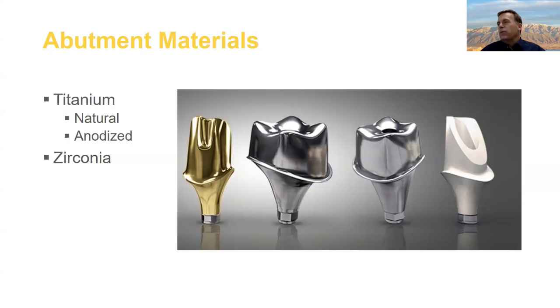But let's say for whatever reason it wasn't done or didn't work. And the other thing is sometimes when we're doing anterior units, especially if we're doing a more cosmetic material like a lithium silicate or a lithium disilicate, this might show through and lower the value a little bit. So some manufacturers and some laboratories will anodize the abutment with a gold like this. It really helps cut down on the graying both through translucent restorations and also through the tissue.